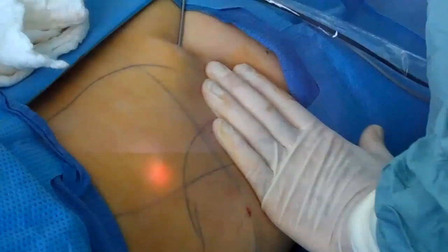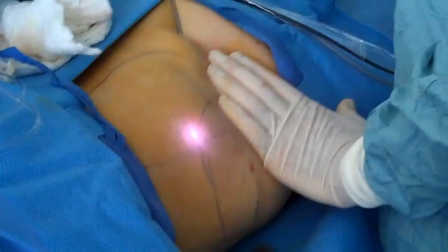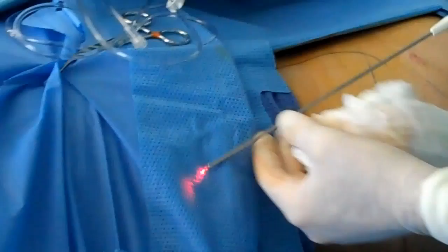We don't see the skin shrink right away — this is something that will happen over the next couple of months; the skin will tighten up. This little device here makes sure that I have movement at all times. If I stop moving, the laser will stop. On the end there's a little temperature probe measuring the temperature inside at all times so I don't get too hot.